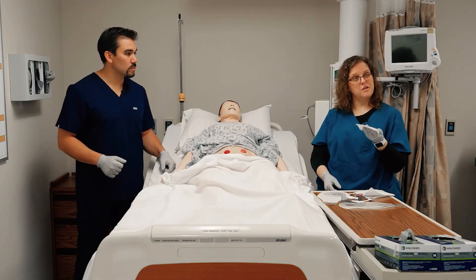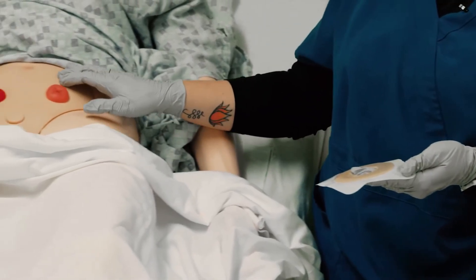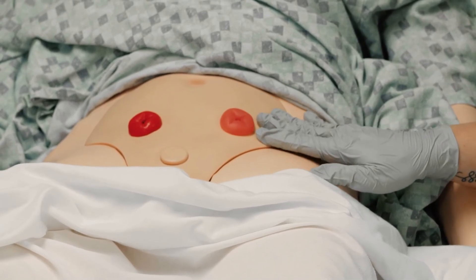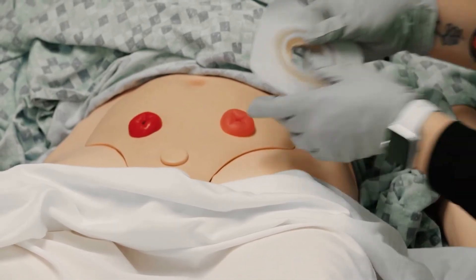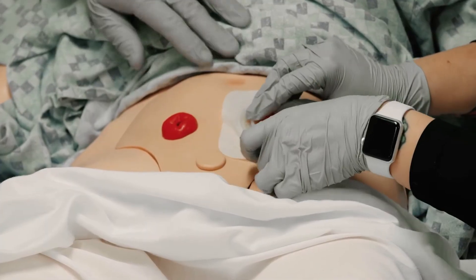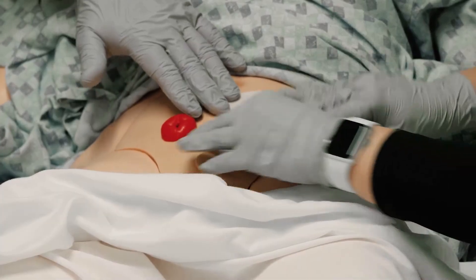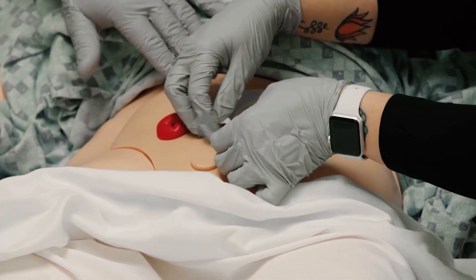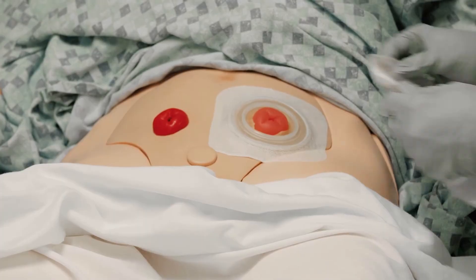All your equipment is going to be a little different, so you have to look at it carefully. If the patient has specific needs, sometimes you'll put down some stoma paste, sometimes skin prep, and sometimes none of that's necessary — sometimes all of it is. You just have to know your patient. I'm going to fit this around the stoma and try to get it as flat against the stomach as possible. If you're having trouble, it's the belly, not you. Otherwise it's going to leak, and then you're just going to clip this on.